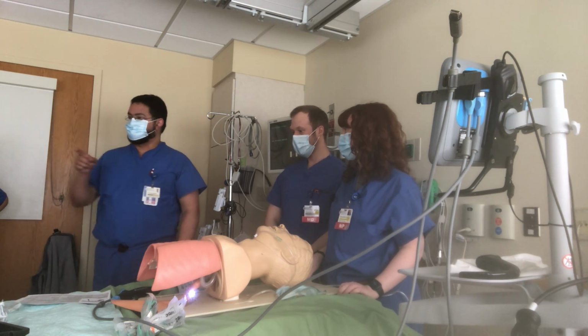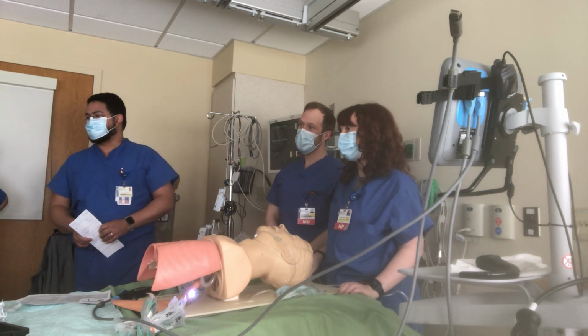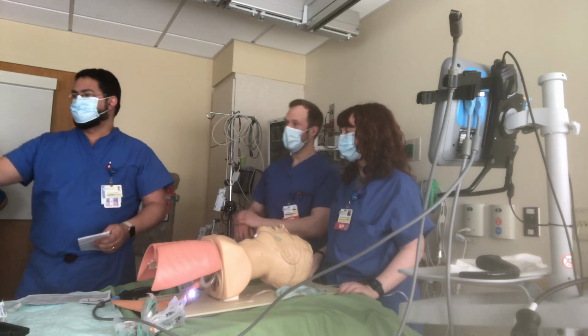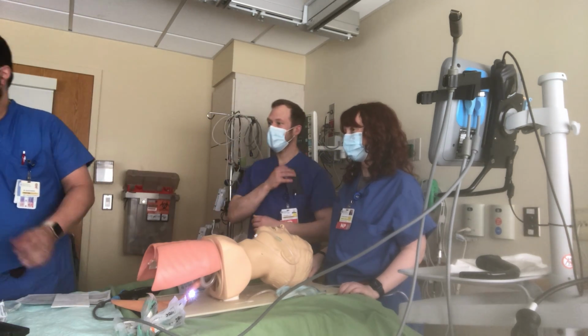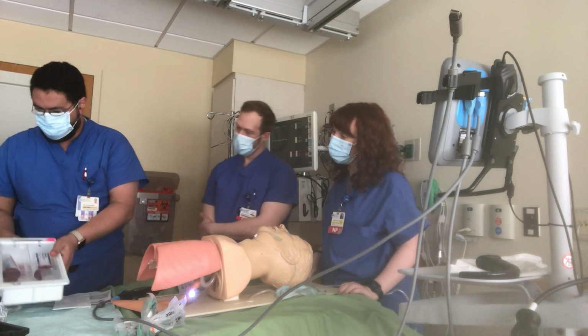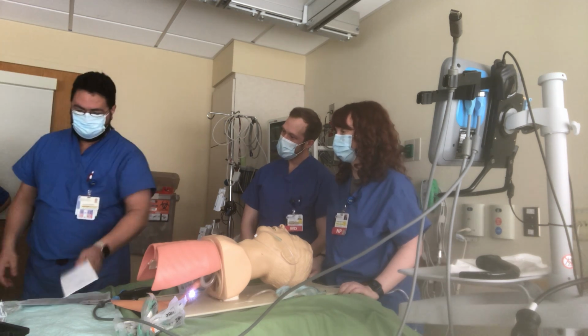Everything that is needed for numbing is in the first drawer here. Open the first drawer and give us all the meds there. It's in one box. Yeah, there's the whole box here. There's so many. All right, so right here. Do you open the box? Show me. Things take time.